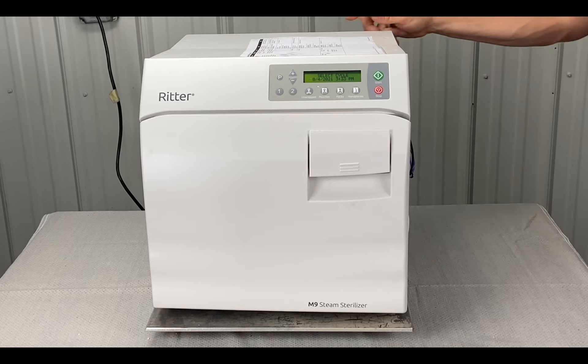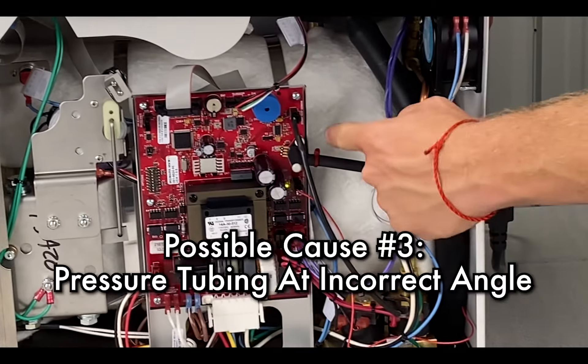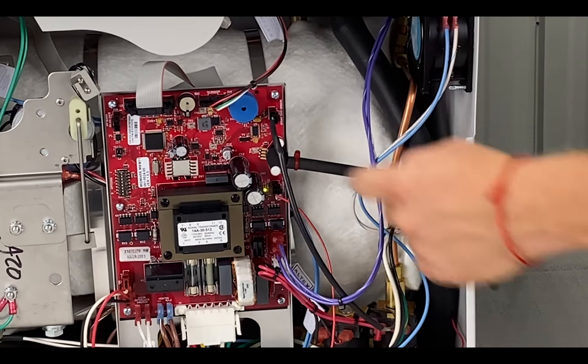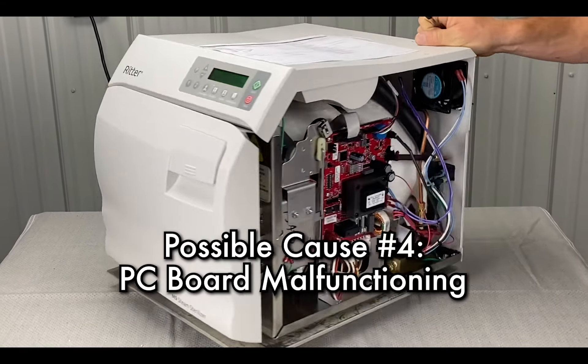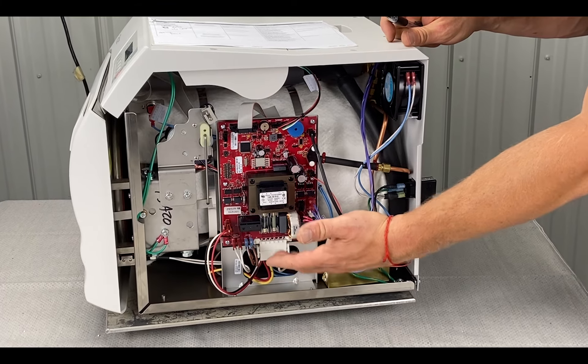It could also be that the pressure tubing is at the incorrect angle — if it's up too high and kind of goes back that way, it floods the converter and causes intermittent issues. Or it could be the PC board. The relays often go bad too.